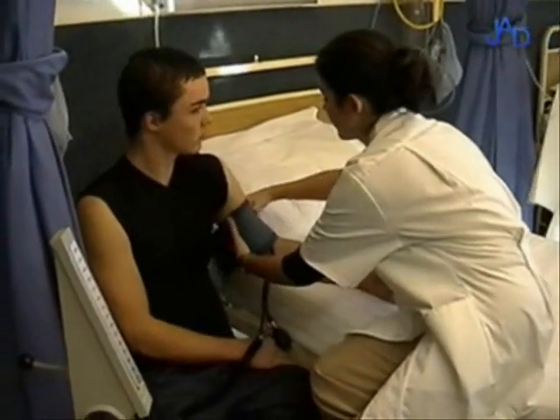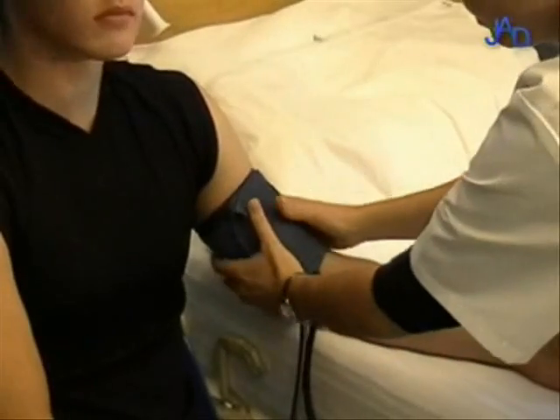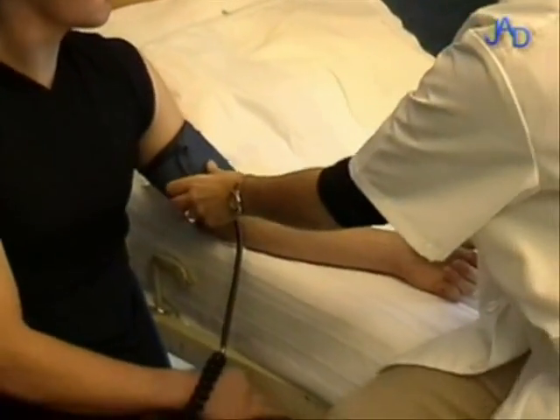Ensure that the cuff is empty of all air before applying it to the arm. The patient must be relaxed and the arm held at the level of the heart.